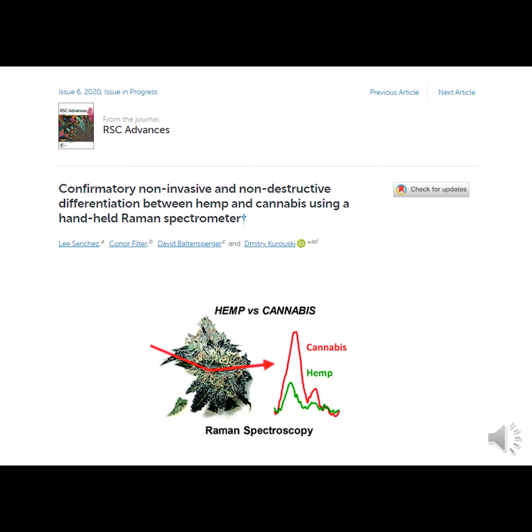There's a great demand and need for a field test for hemp that farmers could use in their fields to look at their plants and determine what the THC concentration is close to harvest. And law enforcement has a great need to have some type of field test that they could quickly use to identify material as being hemp or marijuana in vehicles that they pull over and check.